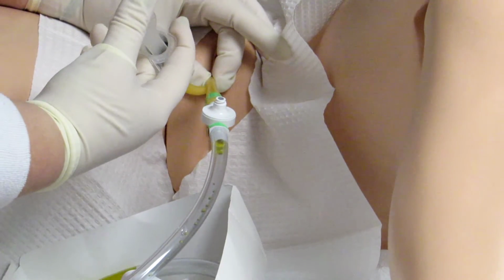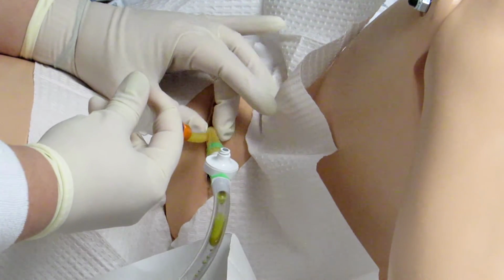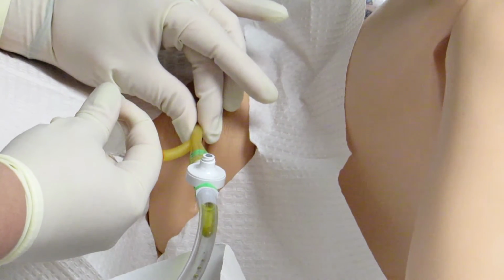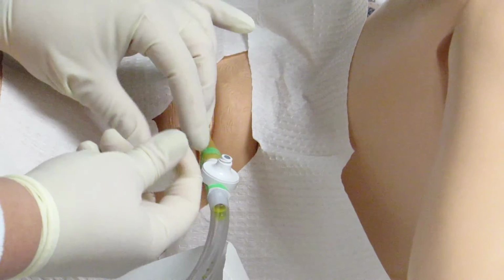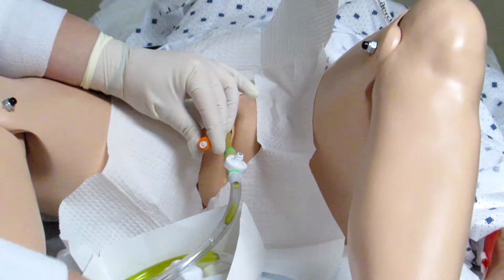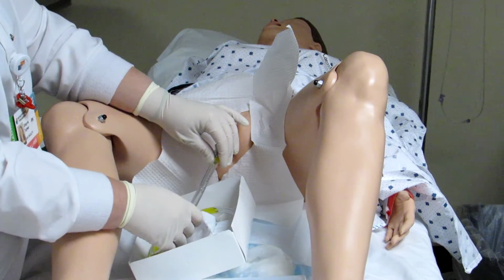Use my right hand here to inflate the balloon. Once that balloon is inflated, I'm going to check for placement. Lightly tug on it to make sure that balloon is inflated and it's really in there. Take my dirty hand, come over here, and untwist the syringe. Now I have my Foley catheter in the appropriate place. You can see I still have urine flow coming here.